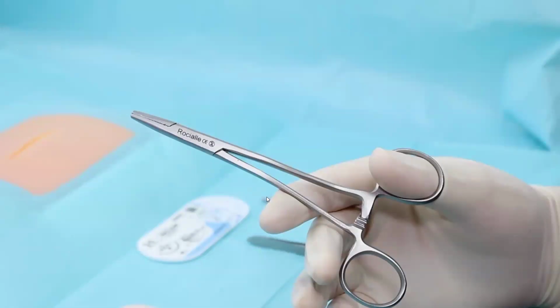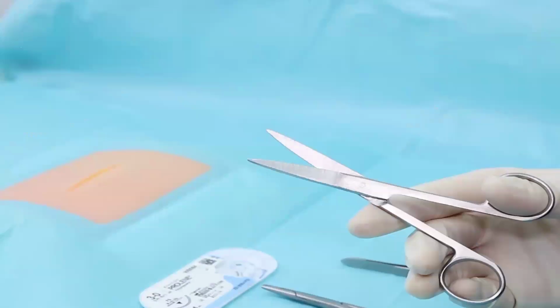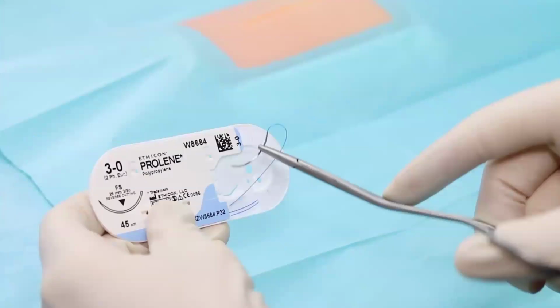So what I will do, both the nurse and I will put on sterile gloves and cover the wound with the drape. I cleaned it before, so I will hold the needle holder with my right hand and forceps with my left hand. With the needle holder, I hold the needle divided 2/3 in front and 1/3 at the back, holding at the 2/3 and 1/3 junction, and without touching the needle, I can touch the thread. Okay, and nurse, could you please hold the scissors so when I need it, you can cut the thread.